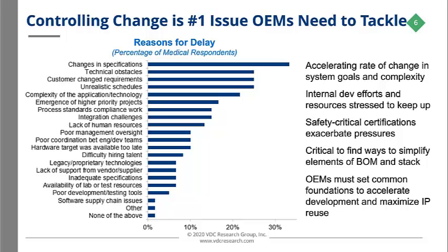And then for many products and projects in the medical sector, you have to layer on the safety critical certification considerations to which many of these devices must align, which really only work to exacerbate some of the challenges that these organizations face. And so given the noted difficulties managing change and the deleterious effect it is having on project performance that we just looked at, it is critical to find ways to simplify elements of the bill of materials and stack. In essence, OEMs must set common technology foundations when they're making their design decisions to help accelerate their development and hopefully in the future too maximize IP reuse.